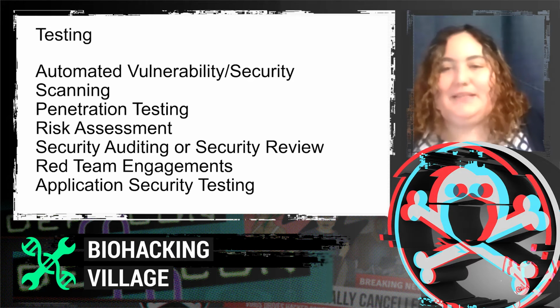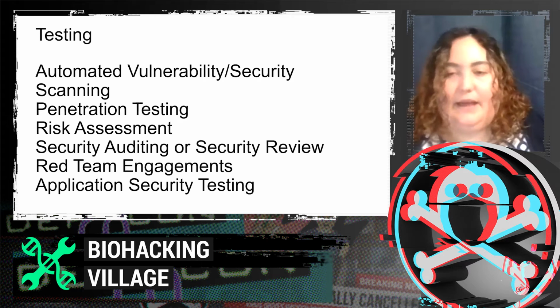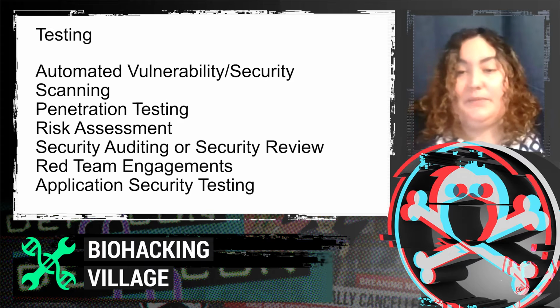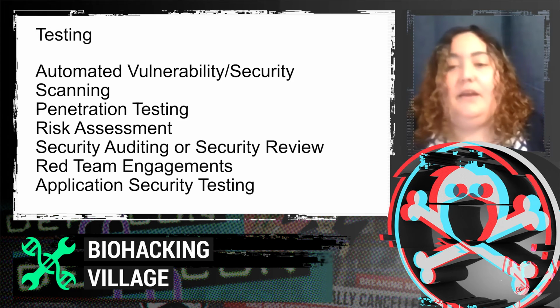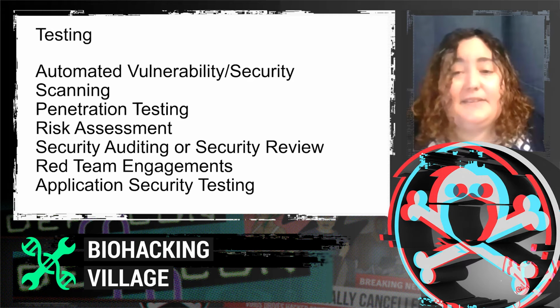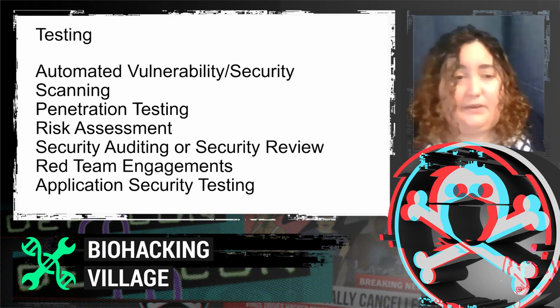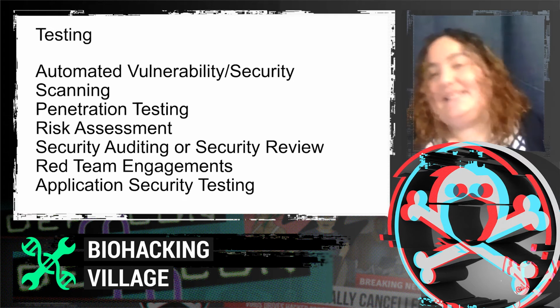Testing. It's not enough to assume that you've applied adequate security controls. You want to make sure that you test different aspects of security, either for compliance, or you might have a customer or a patient that has questions, and if they're a large donor or something, you might be motivated enough to test this.